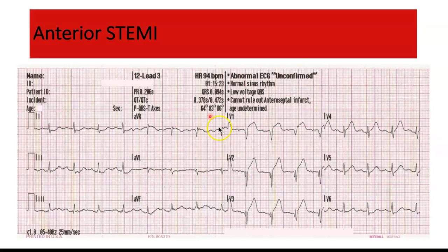The ST segments, if I look here, this is an anteroseptal. So in lead V1, here's the PQ line and the J point where the first horizontal inflection is. We can see that that's more than 2 millimeters of ST segment elevation in V1, in V2, V3, V4. So I would call this an anteroseptal STEMI. And again, it's not an isolated anterior STEMI, it's combined with other areas.